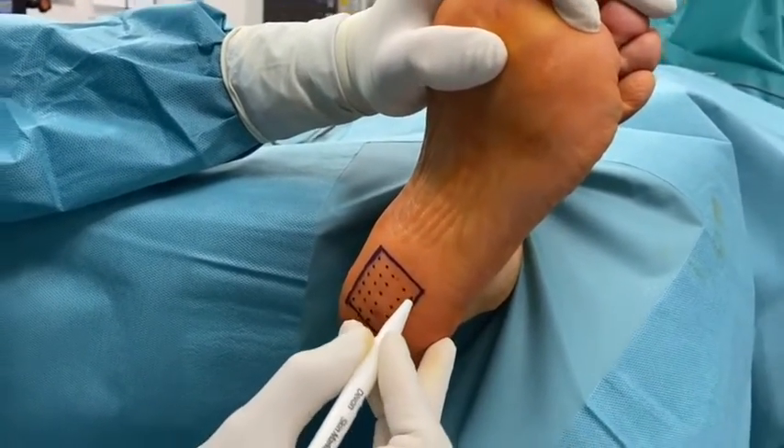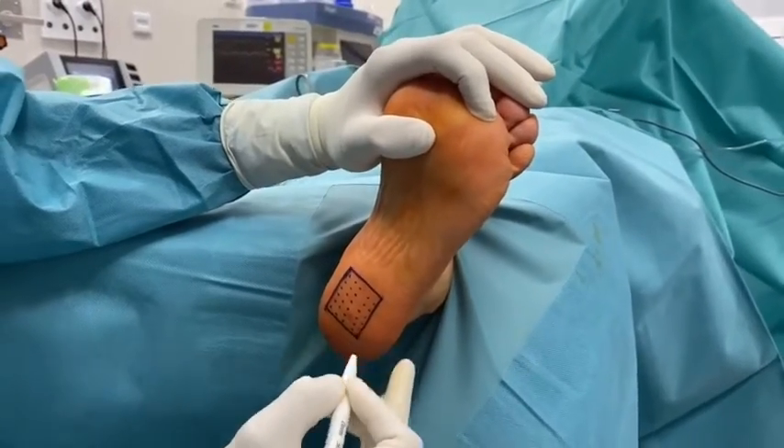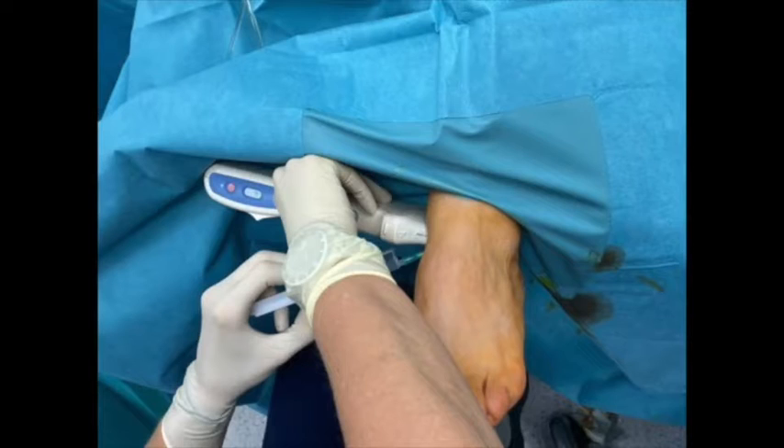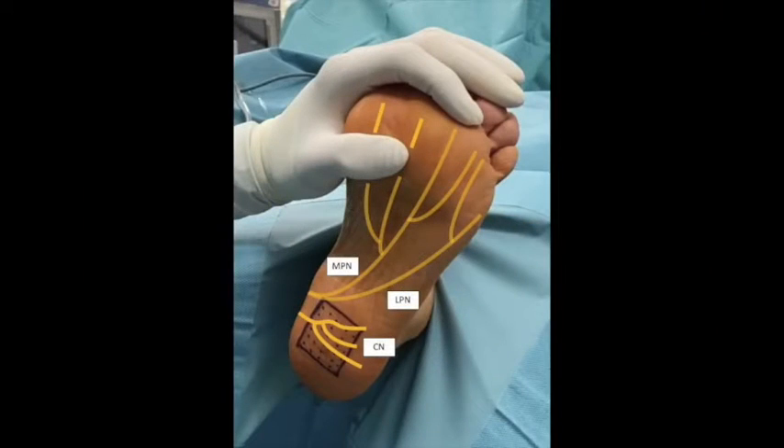The calcaneal branch of the posterior tibial nerve is blocked under local anesthesia with mepivacaine 1%, 2 cm distal of the tip of the medial malleolus. Ultrasound guidance can be used at this point.